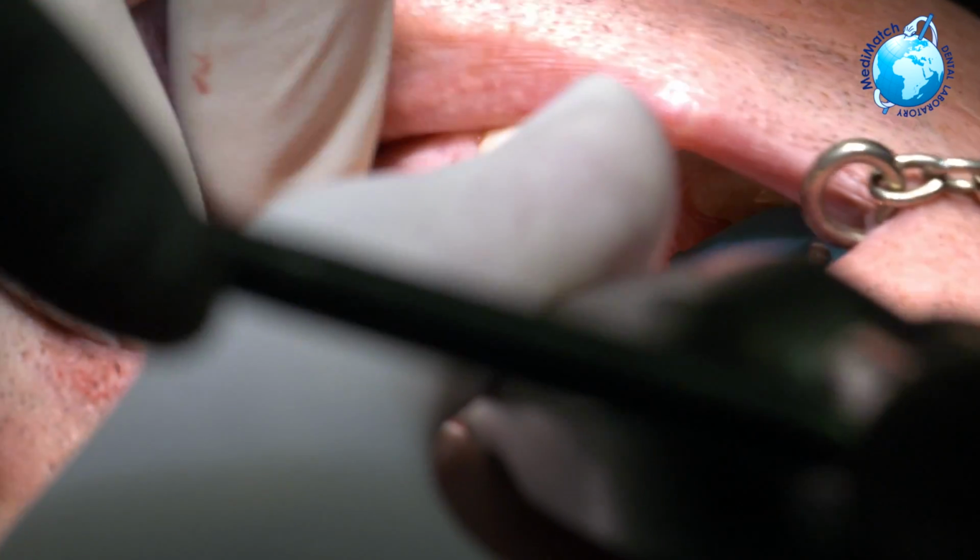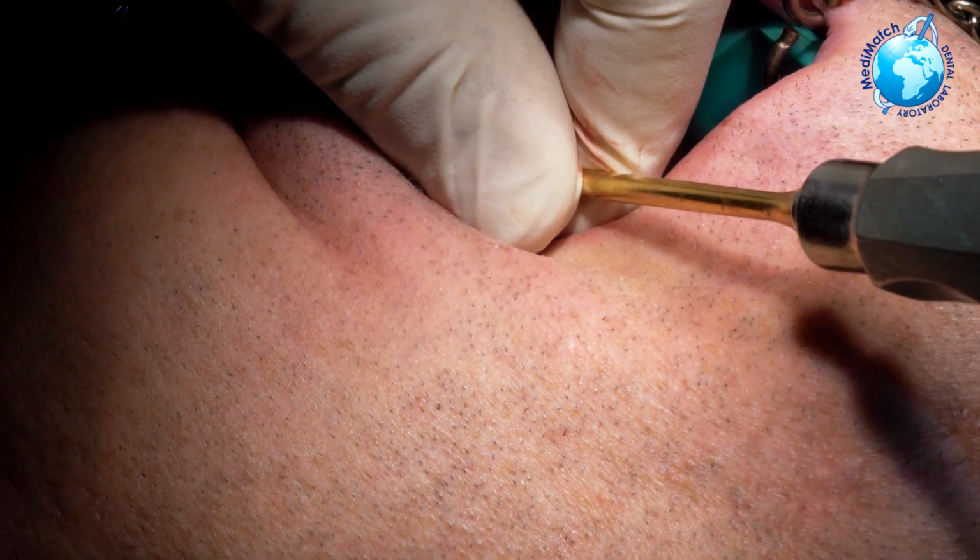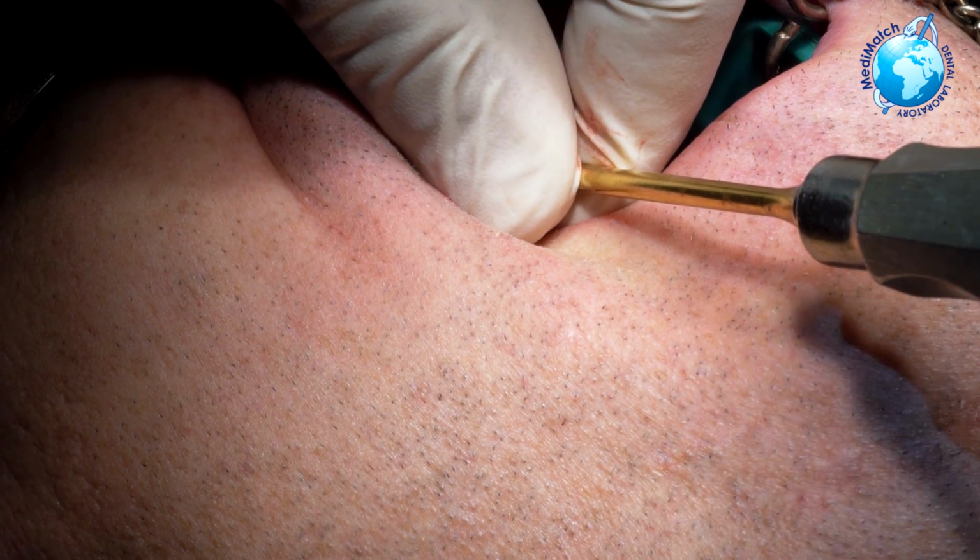Okay, hold it there. Alan? Just a little bit sharper tapping that I'm going to do now, okay? Just bear with me, yeah.